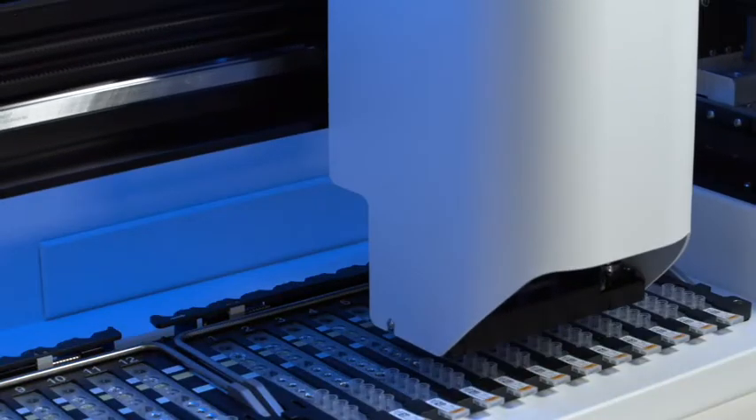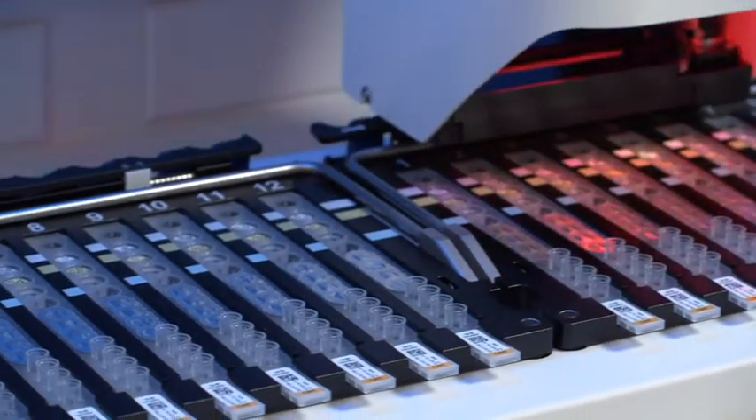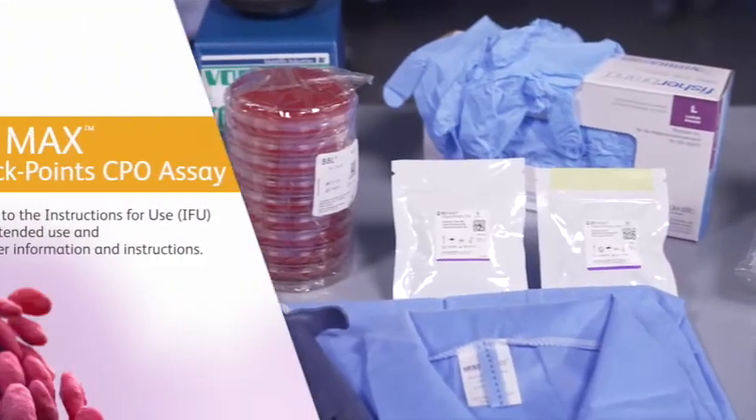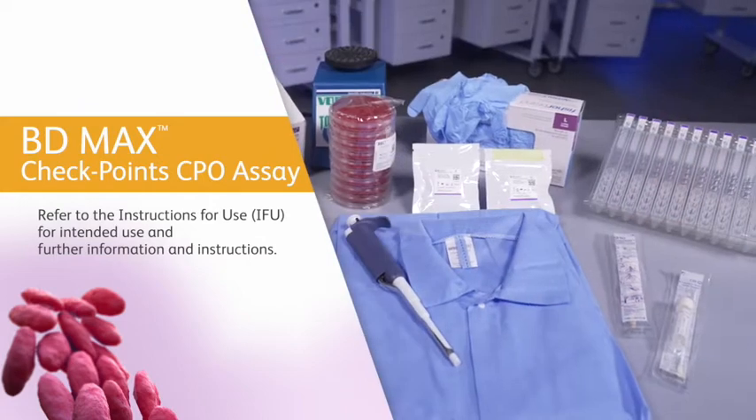The BDMAX system automates sample extraction, nucleic acid amplification, and detection of the target nucleic acid using real-time polymerase chain reaction, PCR. For a full list of equipment and materials required but not provided, please refer to the instructions for use.